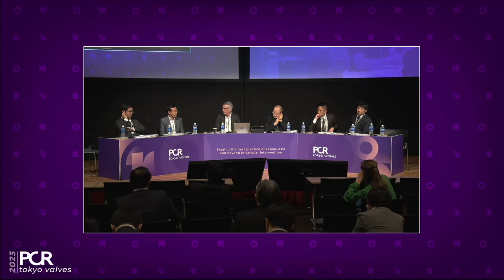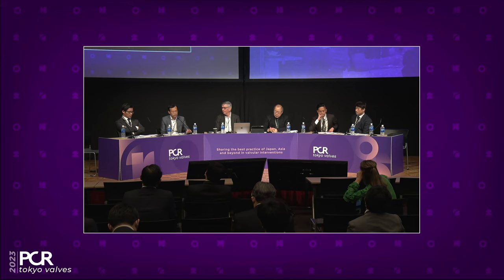Yeah. Mike, we discussed in the first case also about flexibility of the valve and about the stiffness of the capsule. This valve is also quite good if you have challenging anatomy such as a horizontal aorta. Maybe you can just explain again what's the difference between a stiff delivery system and a very flexible one as you see here. Right, with this device, the FlexNav system is really, really good in negotiating all the tortuosities of the descending all the way up to the ascending aorta and then crossing the valve.